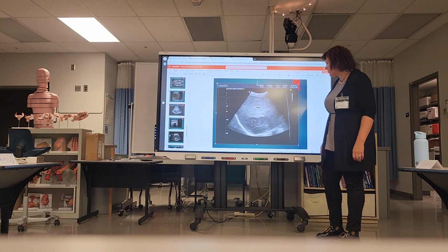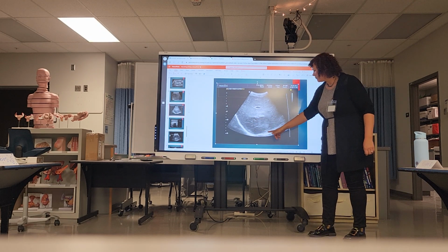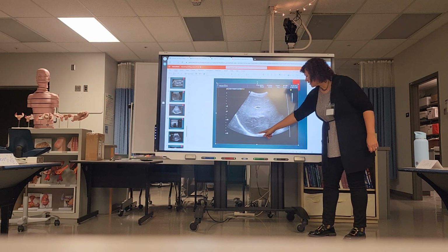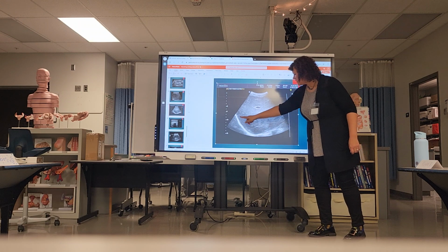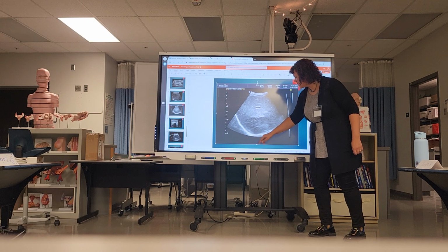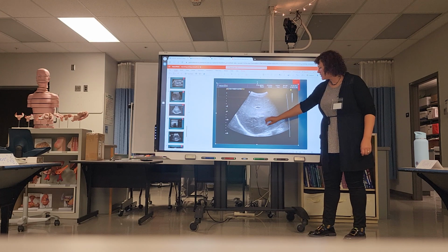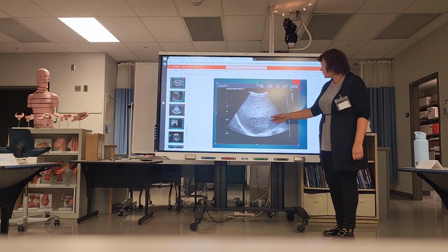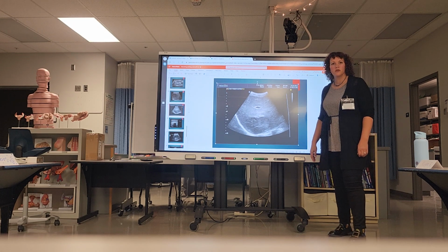And is this a solid or is it cystic? Complex. Solid, yeah. So don't let the diaphragm fool you. This is the diaphragm, it's very echogenic. Looking right here, you can see that this is the same here, right? So this isn't necessarily posterior enhancement, we're just getting very strong echoes from the diaphragm. So yeah, this is a solid. I would describe this as a homogeneous solid mass in the liver with irregular lobulated borders. Does that make sense?